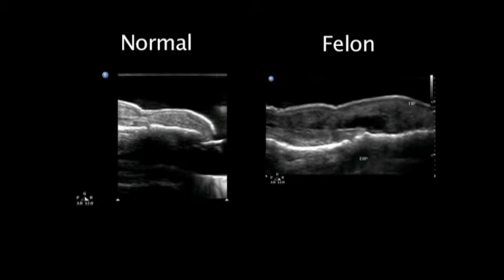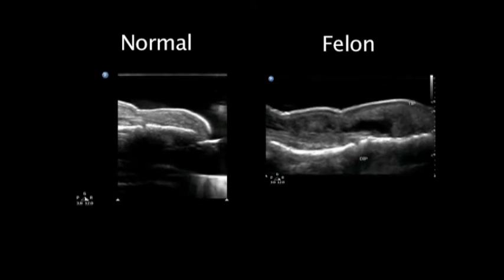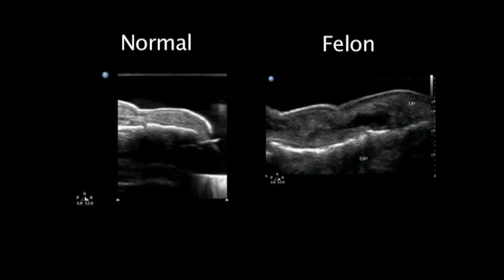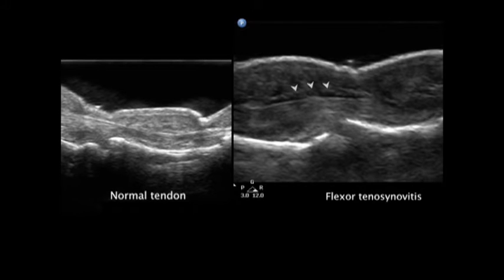On the left side of the screen is a normal fingertip. On the right side of the screen, you can see a fingertip with a fluid collection deep within the subcutaneous tissues. This is a felon. Now, looking at these two still images, the one on the left side shows a normal flexor tendon without any fluid around it. The one on the right demonstrates the tendon surrounded by anechoic or black fluid at the arrows. This is an example of flexor tenosynovitis.